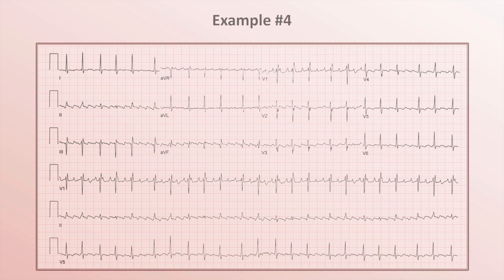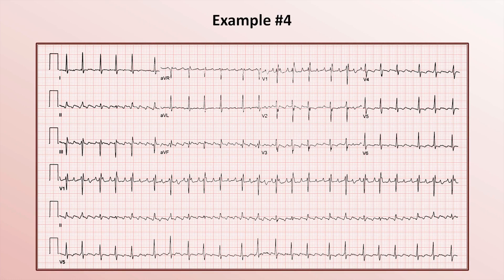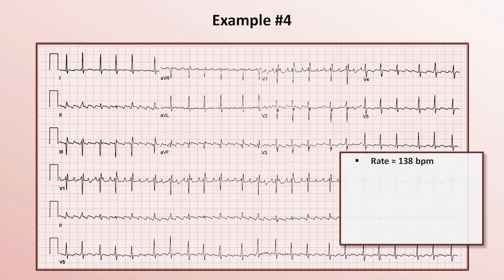Example 4. Using the 10-second rule with 23 QRS complexes across the EKG, the rate is 23 × 6, or 138.